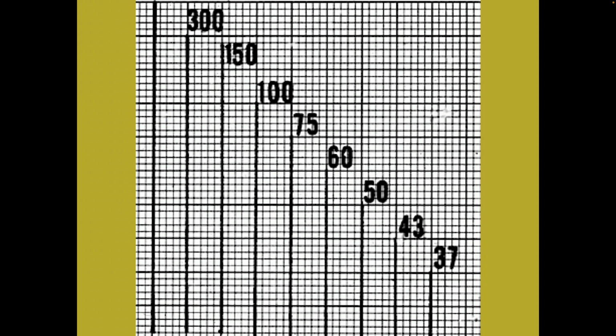So the 300, what did we say, 5 large boxes equals how much time? 1 second. Now, what we're interested in for rate is how many beats per minute, okay? So if 5 large boxes is 1 second, and there are 60 seconds in a minute, that's 300.